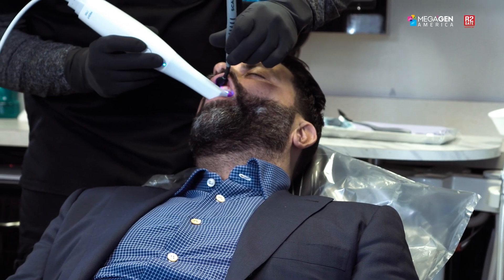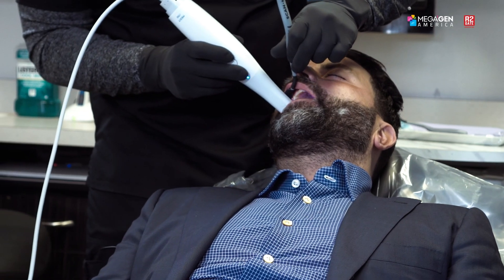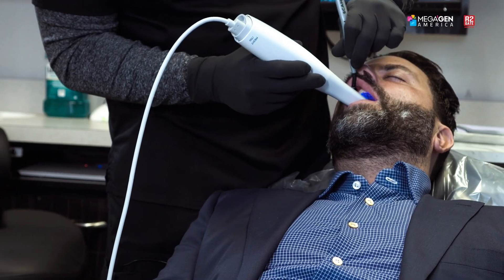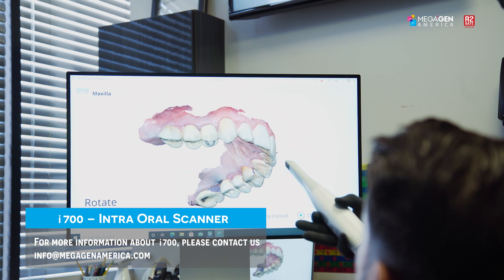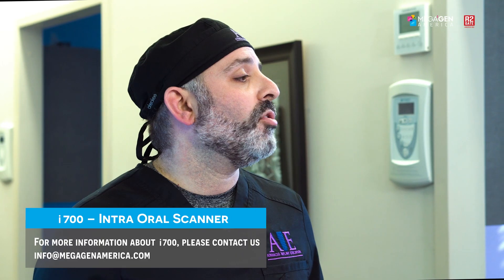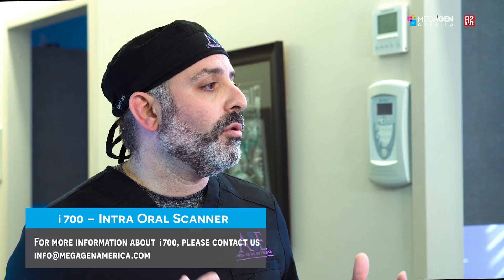That's the new i700 by Medit. Using the new upgrades in the Medit software has improved functioning with smart color filtering as well as soft tissue filtering. There are advancements in multi-occlusion and multiple bites analysis, as well as margin line creation. We have amazing updates in facial scanning, abutment and scan body matching. Denture and impression scans have all been improved, and of course it integrates with all the workflows.